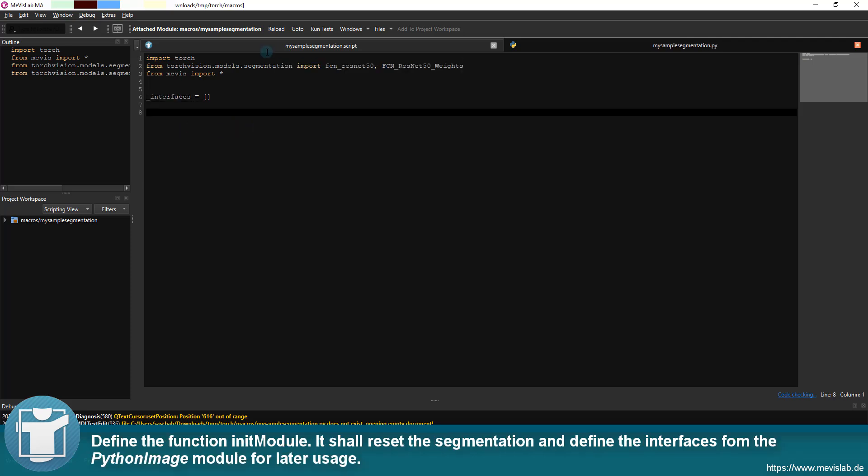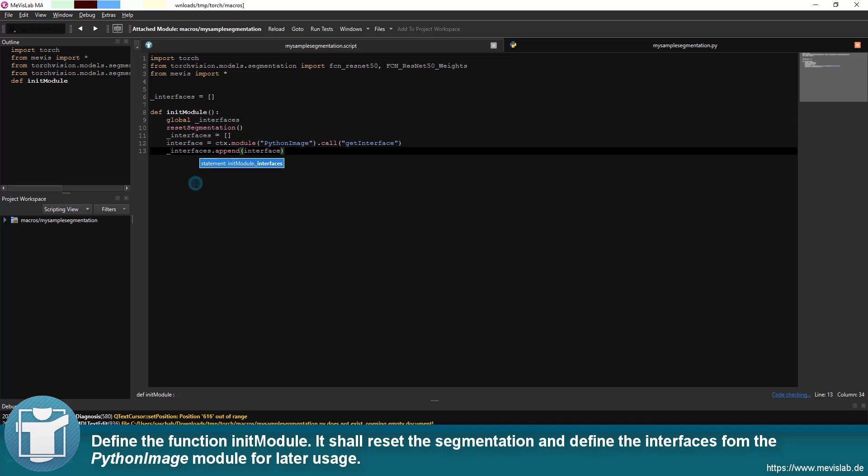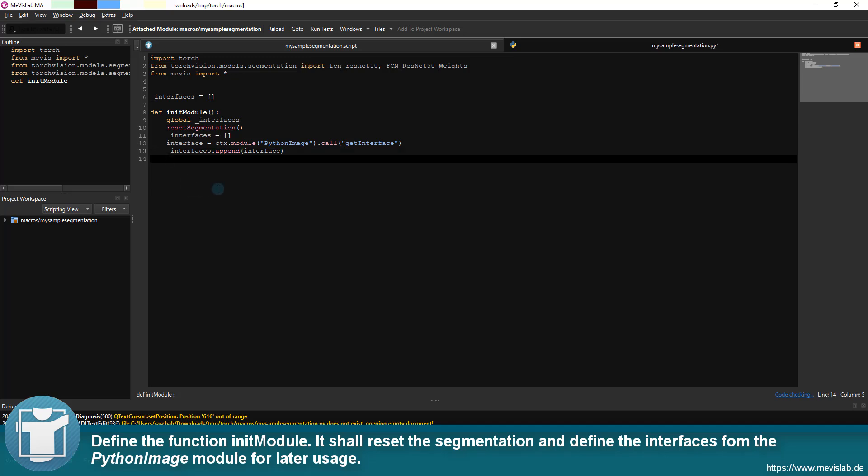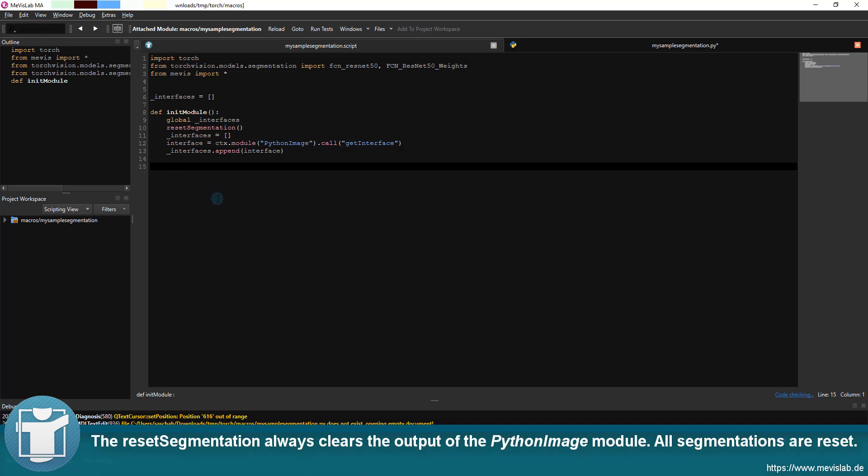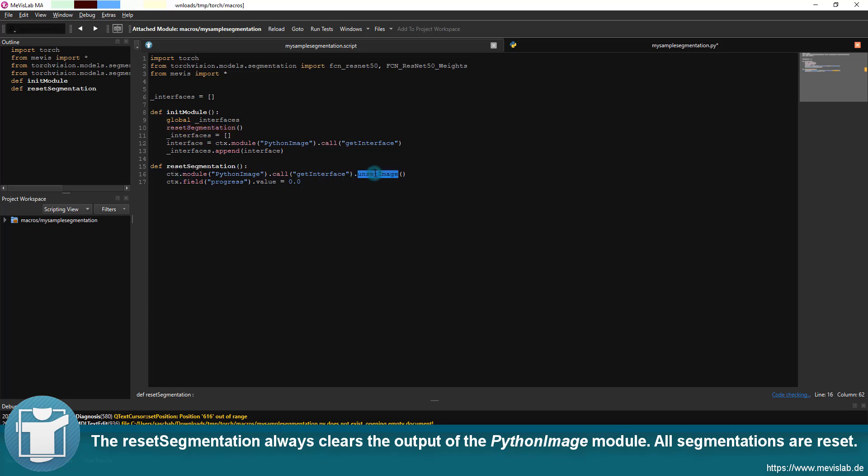Define the function init module. It shall reset the segmentation and define the interfaces from the Python image module for later usage. The reset segmentation always clears the output of the Python image module. All segmentations are reset.